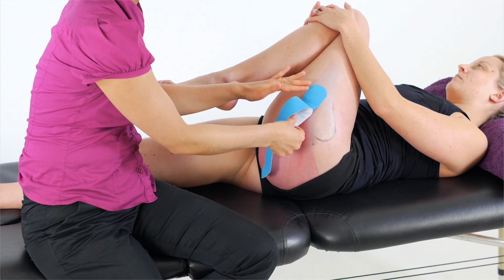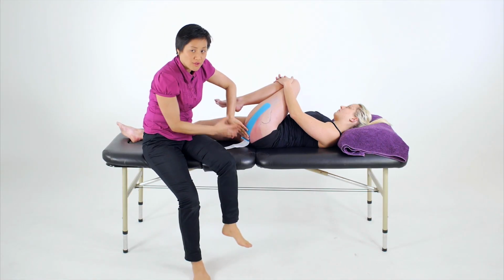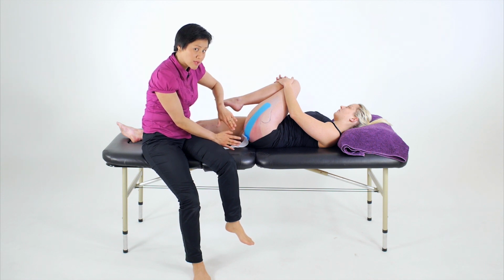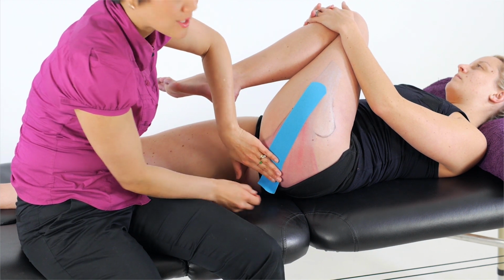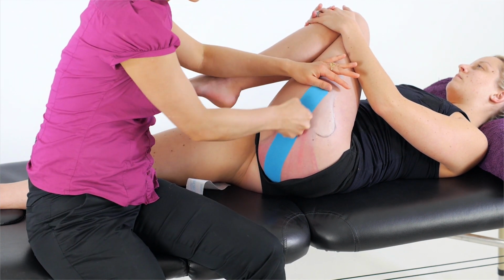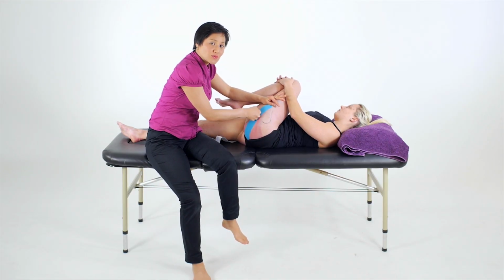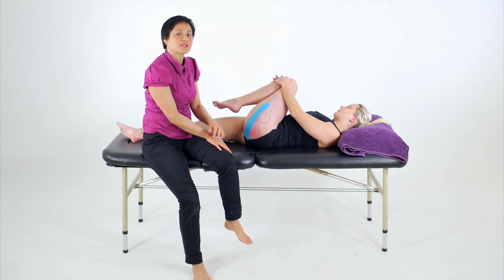And then we'll roll the tape off the backing with 15 to 25% of the available tension towards the origin on the sacrum or the ilium, or whichever direction of the fibres you find that are appropriate during the testing. At the end there, we'll pull the final anchor off the backing, let it settle to zero before placing that on to the sacrum or ilium. Rub the tape to activate the glue. And once we've completed our tape application, we'll make sure to reassess the muscle for improvements in length and strength if it was in deficit as well as retest for any functional changes.